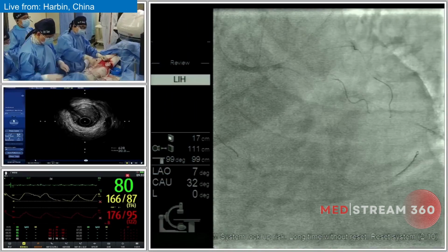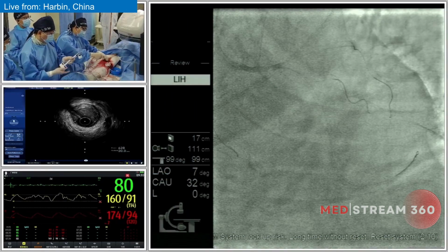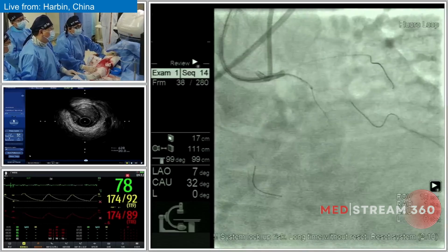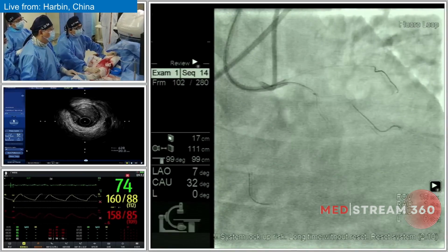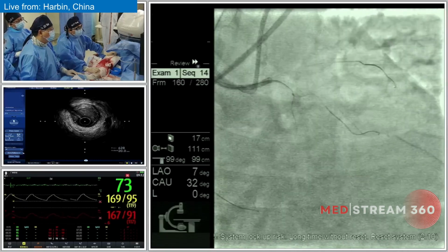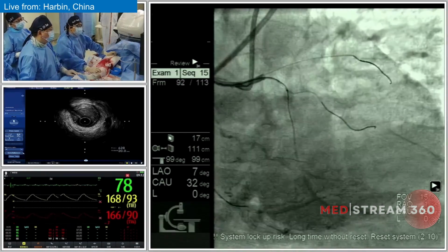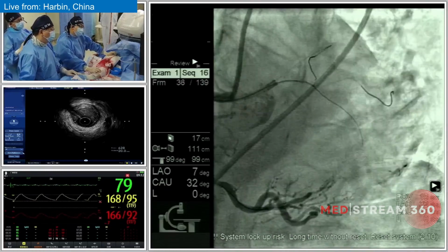So because there's a tapered cap, what kind of wire did you choose to penetrate the proximal cap? As we know, for a tapered proximal cap, usually we choose a softer tapered tip wire with a polymer jacket. For this case, we chose the Fielder XT-R as the first choice. So when you tried to deliver the wire, it didn't feel much resistance, right?